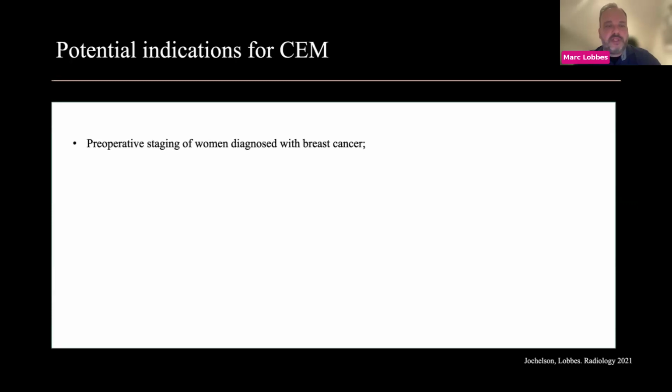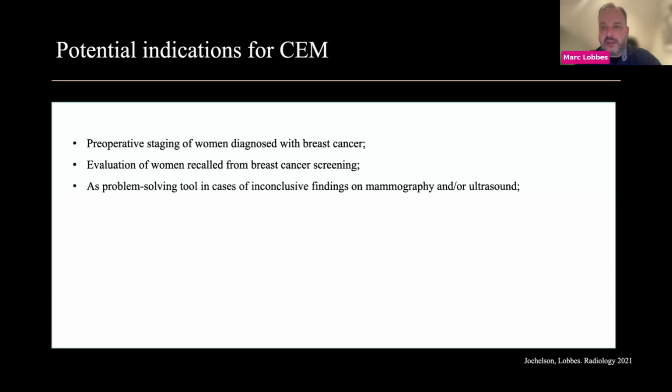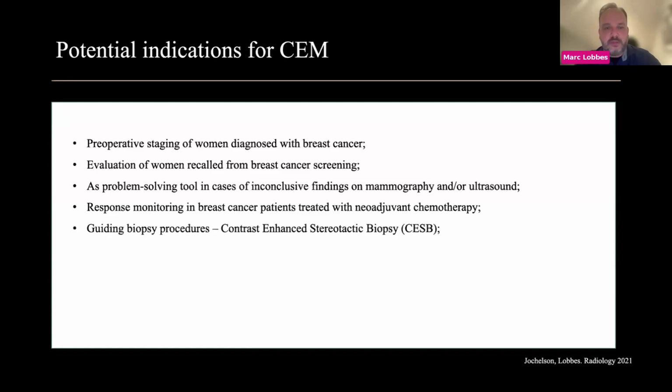Now, we also have potential indications for contrast-enhanced mammography, and these are roughly the indications that we in our institute use contrast-enhanced mammography for. We have the preoperative staging. We have evaluation of women recalled from breast cancer screening. This is the population that I started with doing contrast-enhanced mammography. Problem solving inconclusive findings on mammography or ultrasound. We even do it in response monitoring of breast cancer patients treated with neoadjuvant chemotherapy. Since October last year, we are happy to also have the ability to do contrast-enhanced stereotactic biopsies.